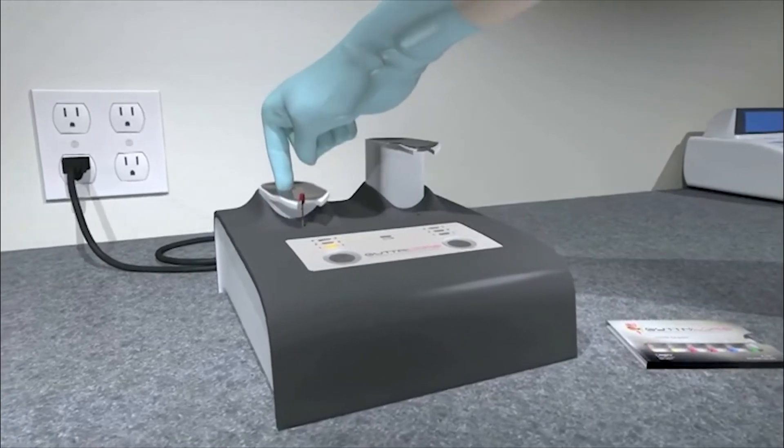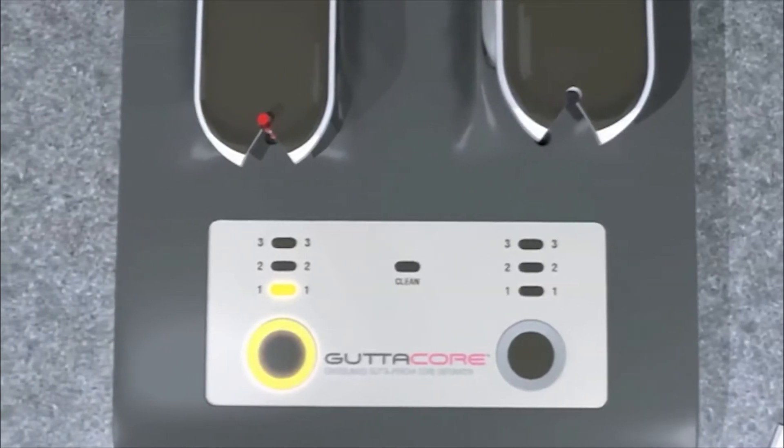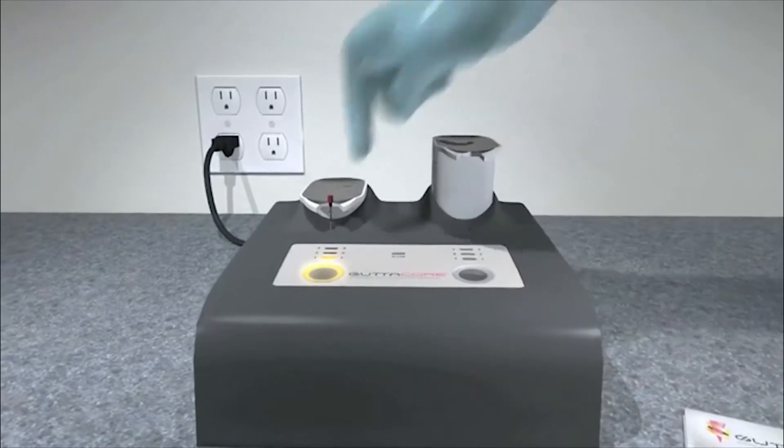Press the oven arm into the heating chamber and heat on the first setting. When heated, press again to release.